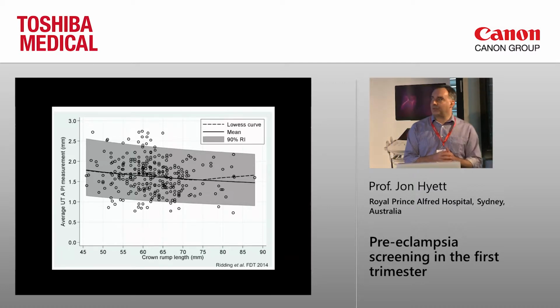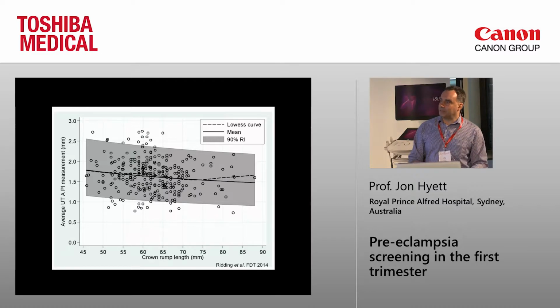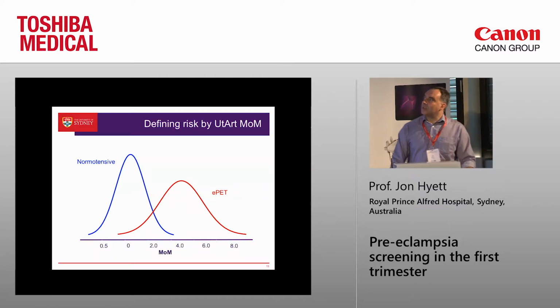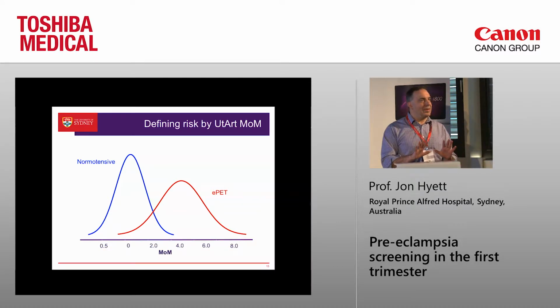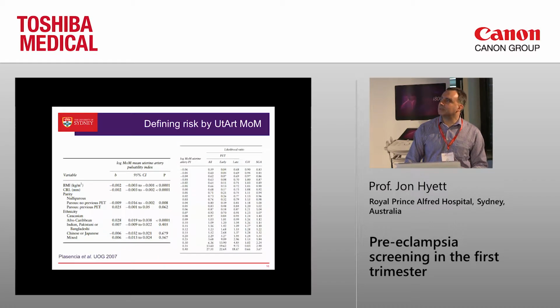Certainly for our sonographers, they quite like to have some idea of what ballpark measurement should be. And we've produced this first trimester range that you can see here. So in terms of risk assessment, we're going to convert this to a MoM value. We're then looking at a normal population, say in blue, the abnormal population in red. So as we're developing likelihood ratios based on these measures, it's very important that we make sure that we have an accurate measurement in the first place.